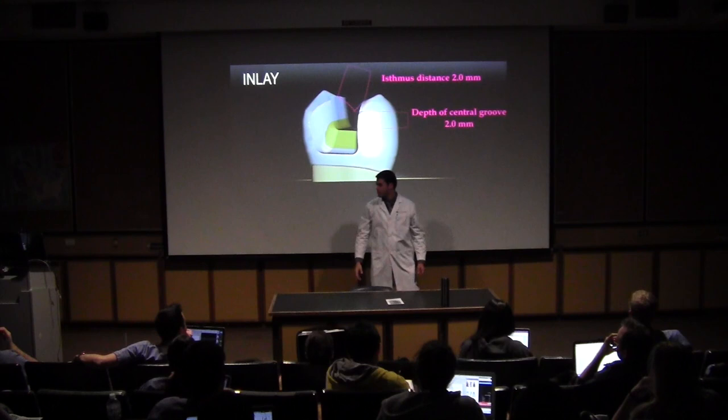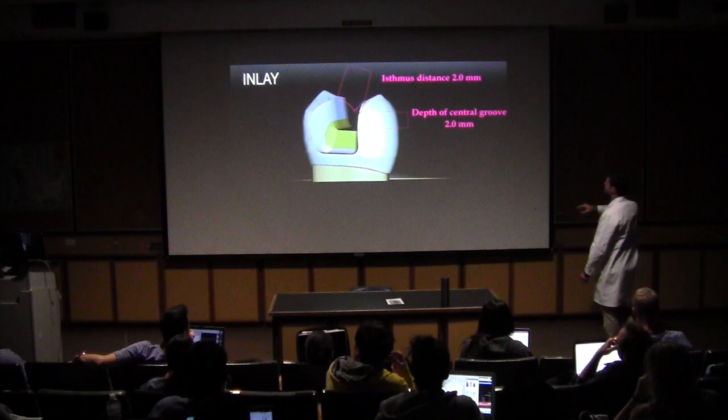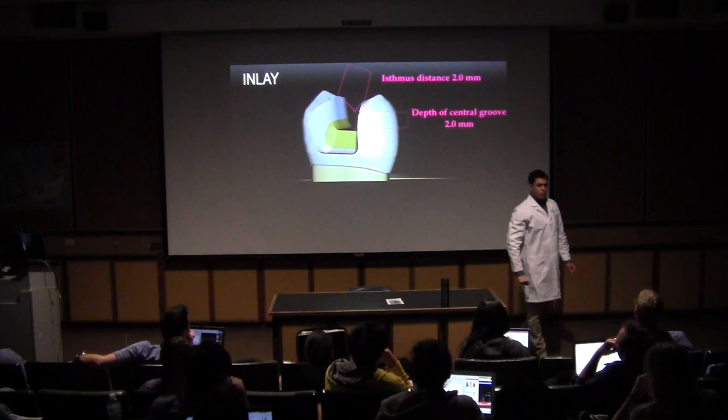And our final prep will have the isthmus distance at least 2 millimeters and the depth of the central groove 2 millimeters from the depth to the pulpal wall. And all the angles rounded. All right? Is it clear?